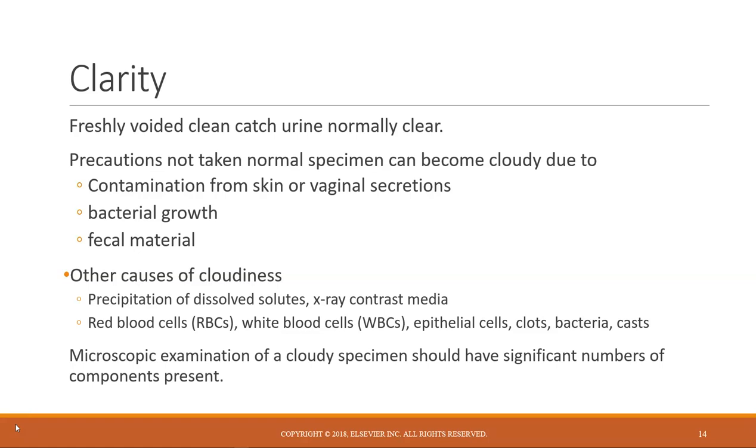Some other causes of cloudiness include precipitation of dissolved solutes, X-ray contrast media, red cells, white cells, epithelial cells, clots, bacteria, casts. So the bottom line is, when you see a cloudy urine, you will expect during the microscopic examination that there will be significant numbers of components present that are visible under the microscope.